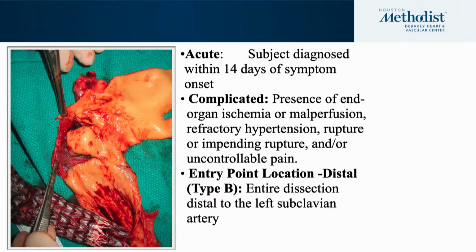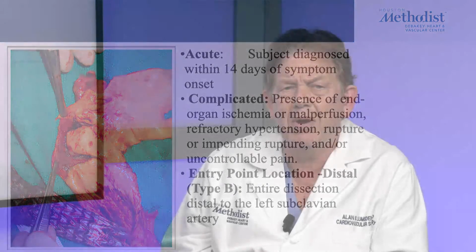This is actually a young woman who had Marfan syndrome, transferred here many, many years ago. She was kind of in extremis, but she was only in her 20s. We opted to put the stent graft in first, see what we could do, and then we opened her abdomen. Basically everything in her abdomen was dead. But we did get an autopsy. We always try to get an autopsy, and interestingly, there were actually two tears. We only picked up one tear on the CAT scan.